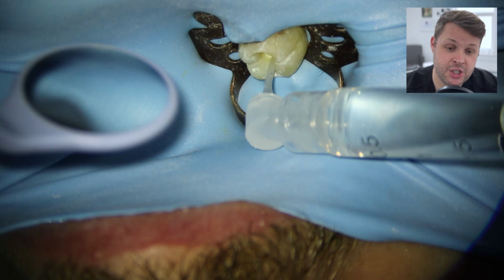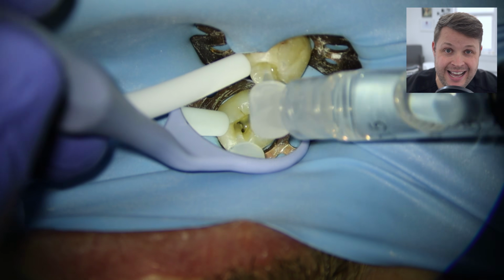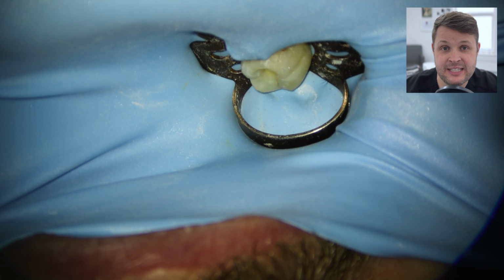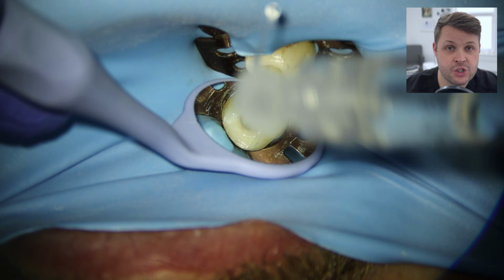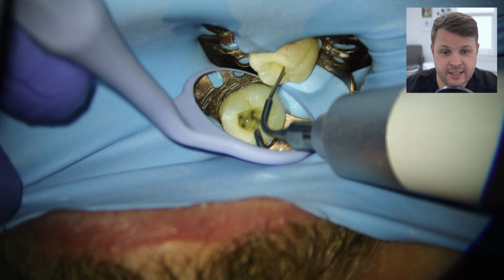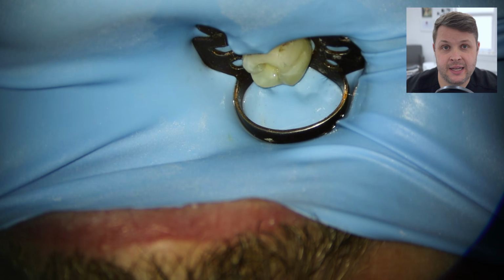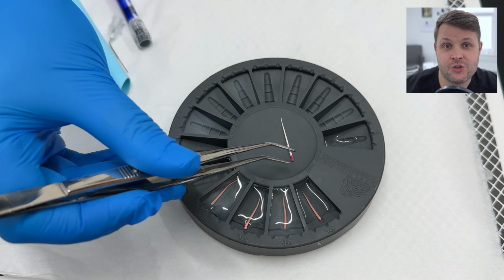So prior to obturation, I'm going to do my irrigation protocol. Sodium hypochlorite activated, EDTA 17% activated, and then a final rinse of sodium hypochlorite, and this is activated. And once we have cleaned everything out, I'm just going to aspirate my sodium hypochlorite, and then I'm ready to dry with paper points.